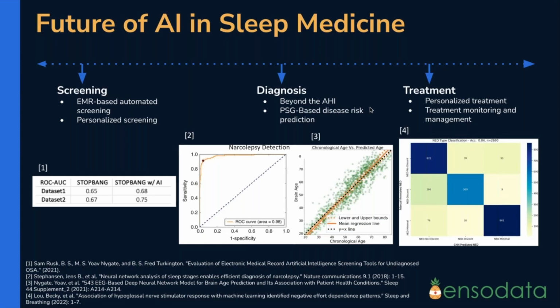And this is especially important for the PAP treatment. As many of you know and appreciate, it's very often very difficult to get patients to continuously use a PAP machine, and it usually involves a lot of outreach and interactions with the patients. So you can imagine how AI and machine learning can be used to try and forecast at-risk patients, patients that are about to become inadherent, for example, based on CMS criteria, with the PAP machine.